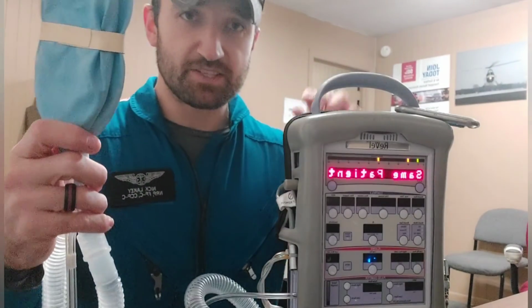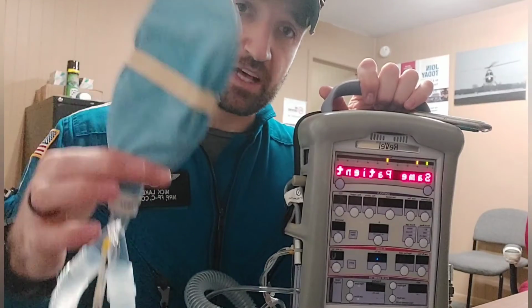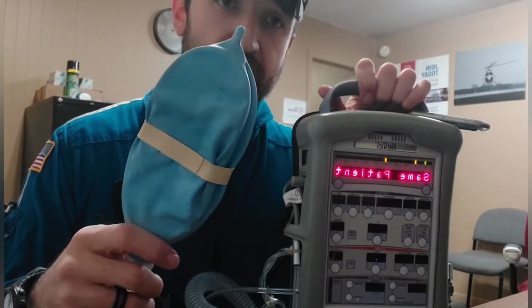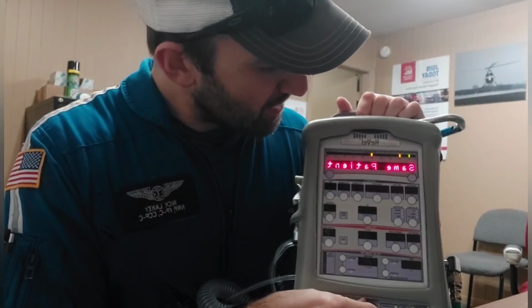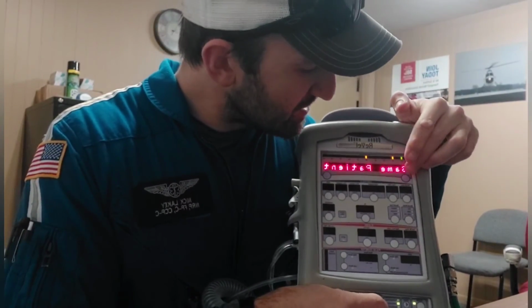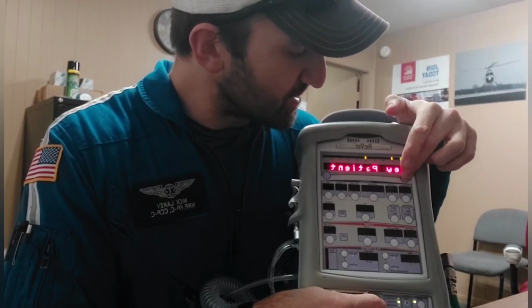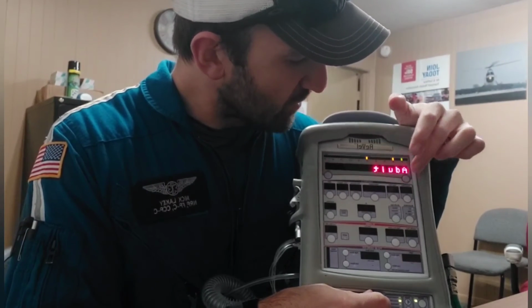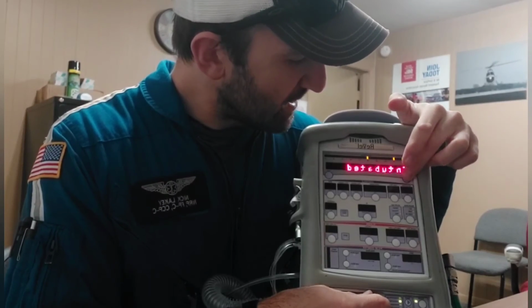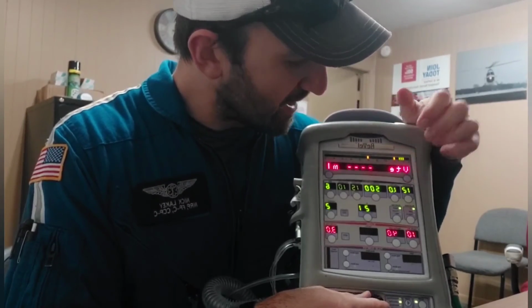Now I've applied a test lung, so that's what we're going to be using for today's demonstration. I'm just going to set that down while we show you what we're going to do. So it gives me the option up here at the top. I'm going to go over to new patient. We'll hit select. We're going to go to patient size. I'm going to select adult, and he's intubated, right? So it's automatically going to start ventilating.